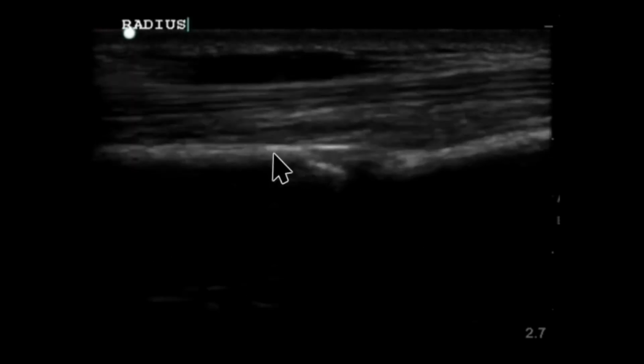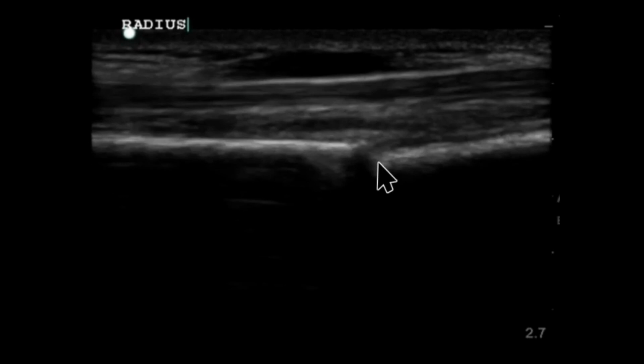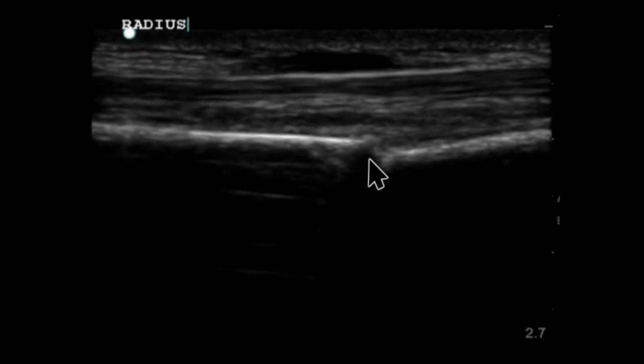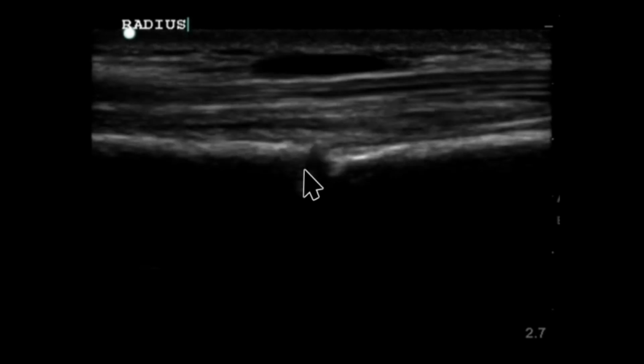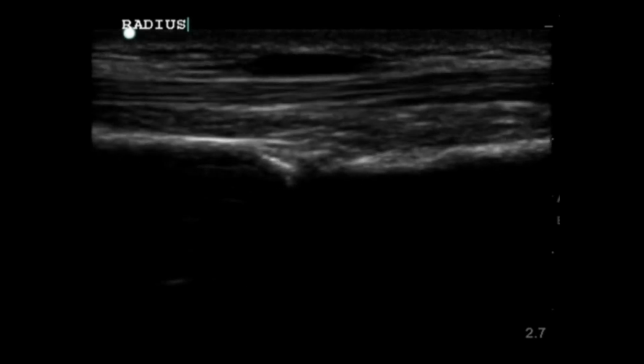And here's the same patient post-reduction. The bony fracture is reduced, there's much less angulation, and the cortical margins are aligned. The patient is now ready for splinting.